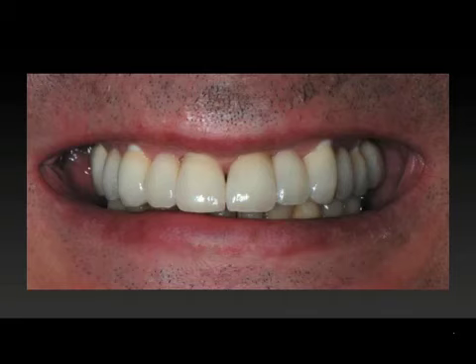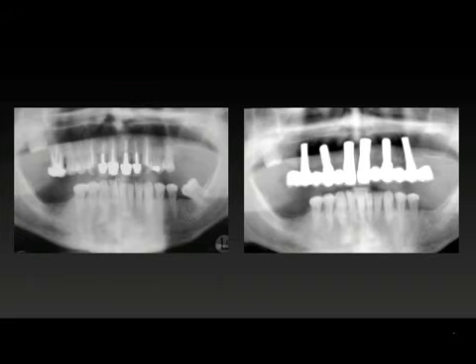This patient came in with periodontal issues. We want him to leave with something that is much more maintainable than putting a margin subgingivally. And it is our findings that there's much more health, much more ability to maintain these restorations long term when you're able to keep the margins in a place where the patient can clean them. This is the preoperative view, and again, we did this on 6 CeraRoot 14 implants with a single cantilever on the ends, cantilever that's not being loaded, and these are 2 separate bridges.